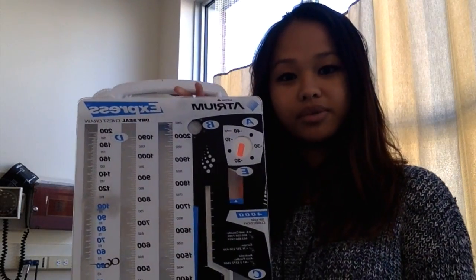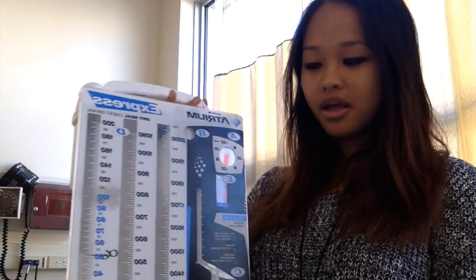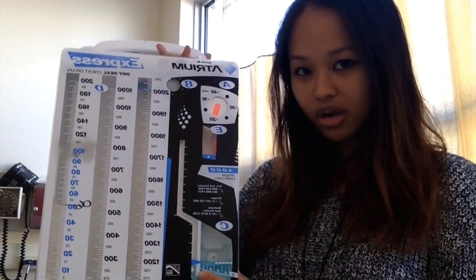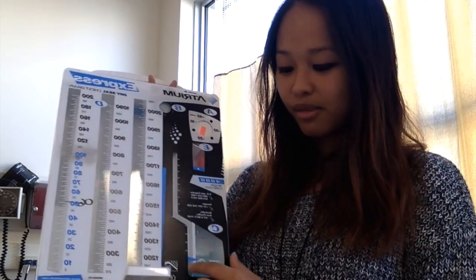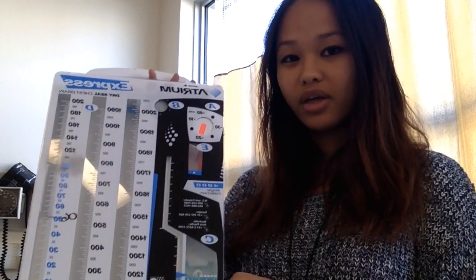Otherwise, I'm going to keep going up into my chest drain, making sure there's no bubbling up in this chamber. If there's trouble bubbling, such as there's a leak in the system, the bubbles will continue up until 5, and at that point I'm going to go ask for help, maybe a physician or any other nurses, just to stop the connection and make sure that the patient is okay.